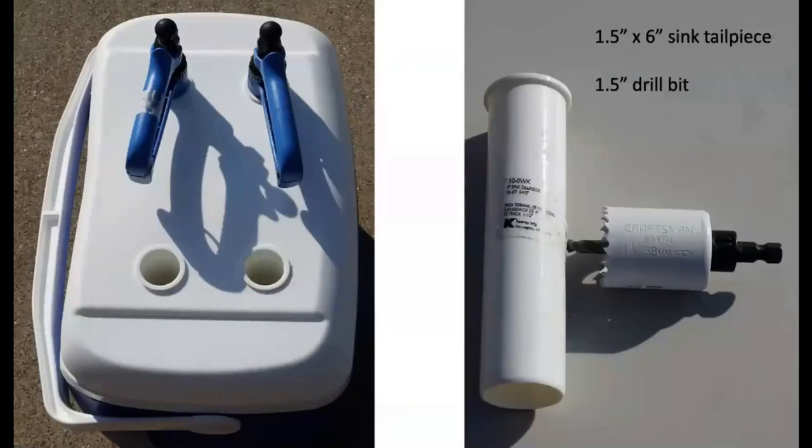You can also make a setup for yourself. This is just a regular ice chest you can go buy pretty much anywhere. I just took a 1.5 inch drill bit and drilled some holes in the lid. I like going in from the top versus the side. It's just a little easier for me when we're working cattle. I will only drill enough holes for however many syringes you're going to be using. This is my demo model, so I put 4 in there, but for the one we use, typically we'll only put 2 or maybe 3.